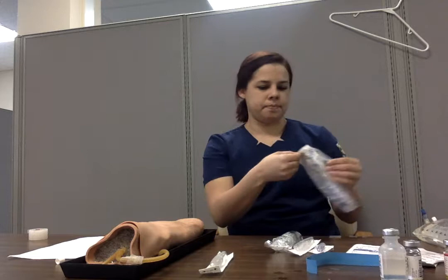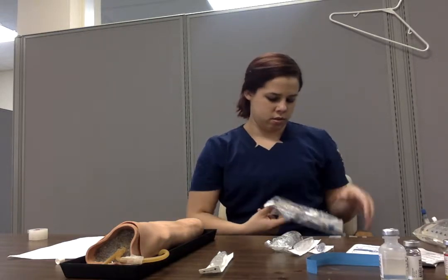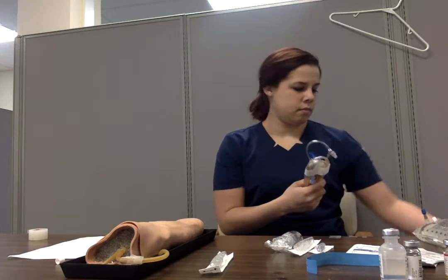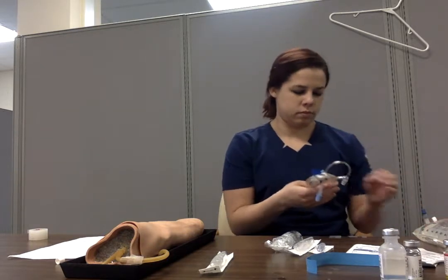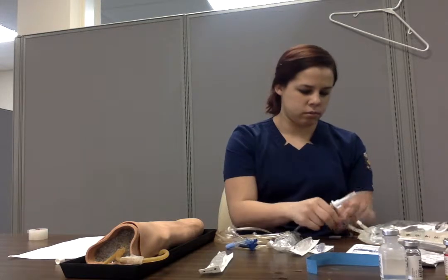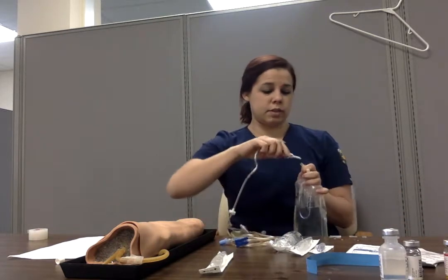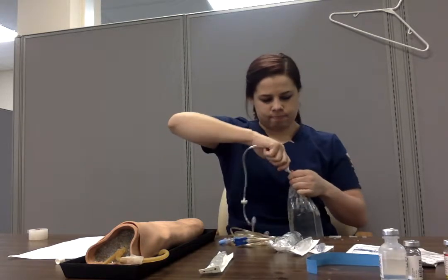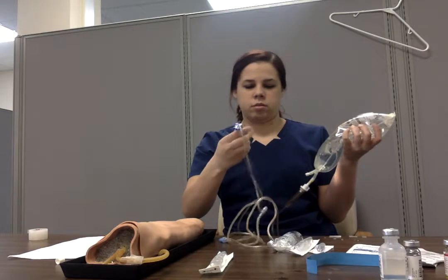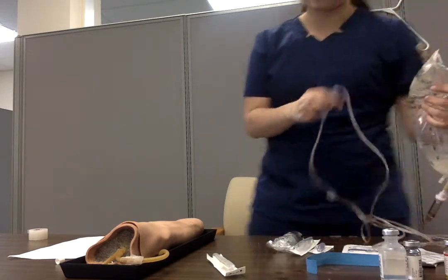So I'm going to get my tubing, and I would check them all. Make sure the orders are still in there. I'm going to spike it. And I make sure my clamp is closed. Then I would take this to the patient's room.